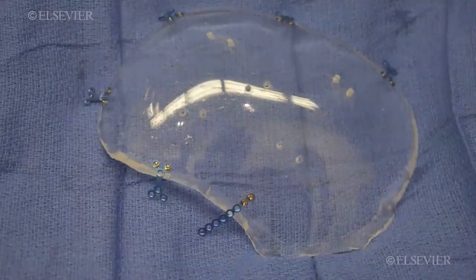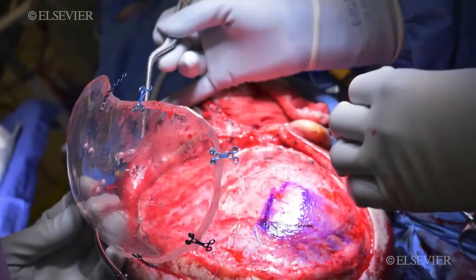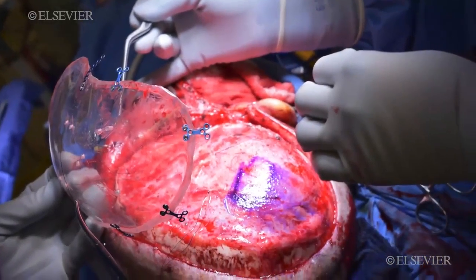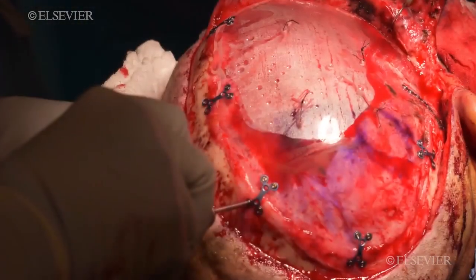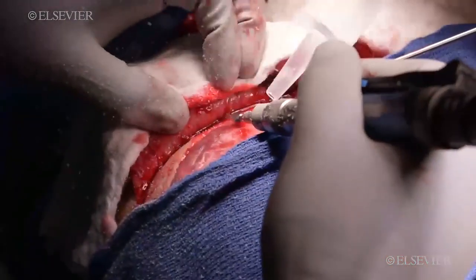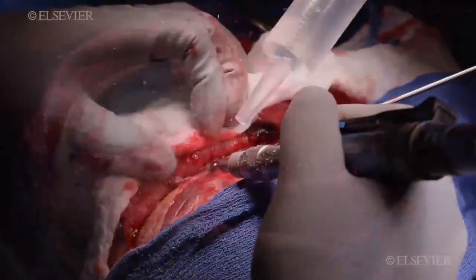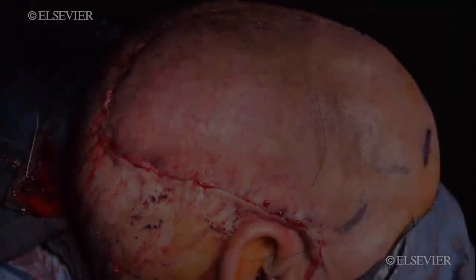A wire passing drill bit is used to place drill holes, and the pre-plating is performed on the back table. At this point, we pass the tack-up sutures through the cranial implant, and using 4mm screws and low-profile plates, the implant is inset. Fine on-table adjustment is made using a high-speed drill.